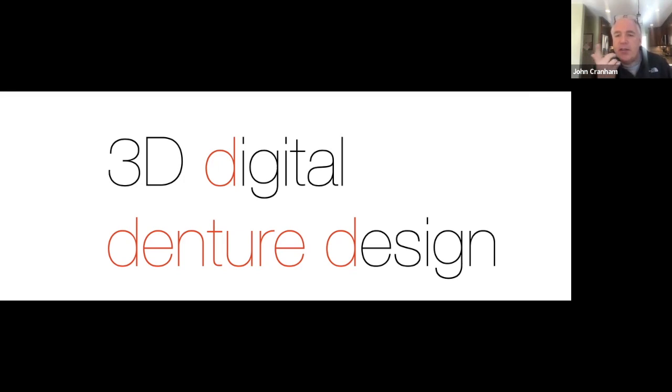Do you know of any of the other ones that do, Lee? So the challenge, and this is the challenge we had with Bellis in the beginning. Bellis was a consumer app. It was not medical dental. It wasn't until we pointed out to them how it could help us. But then the problem was I could import a Bellis scan into 3Shape, but it was not until 3Shape allowed the import of the PLY file that you could do anything with it.